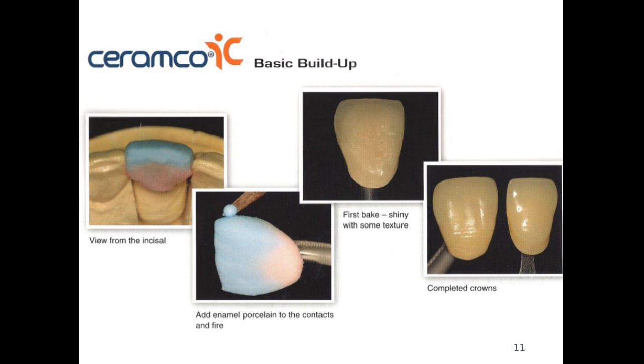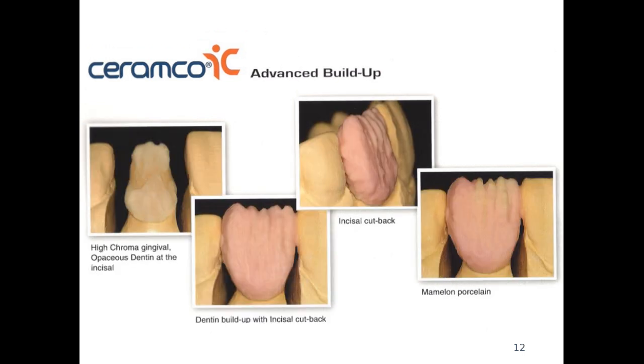Once the first bake is done, the baked porcelain has a little bit of a glaze — that's the natural way of the porcelain to have a slight shine after baking. This is where we can start looking at the texture if we need to apply any surface texture, and also at the color to check if the shade matches. For advanced buildup cases where we have to copy very detailed natural dentition, there is no crown or natural tooth that has a straight color — it's always a combination of different shades and characterizations that we have to copy.